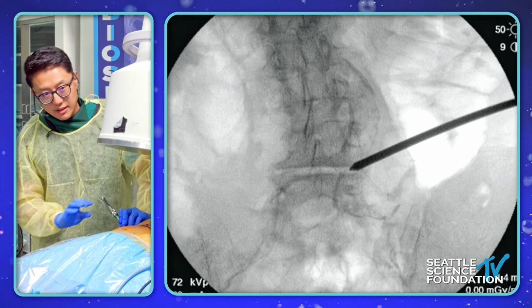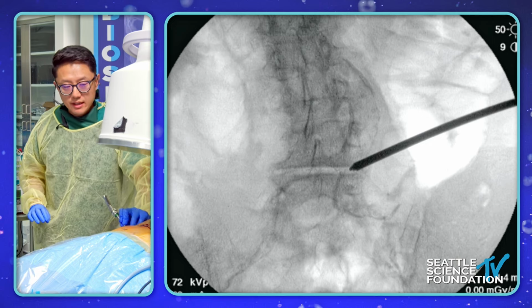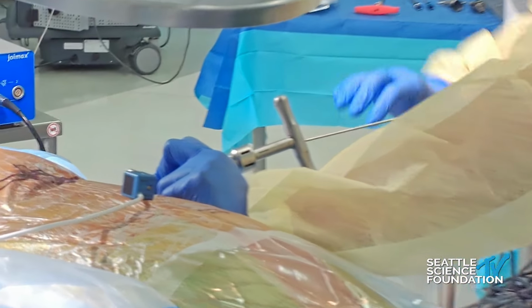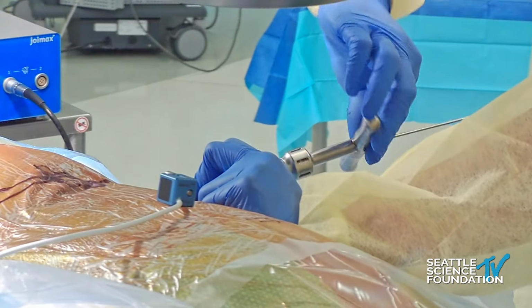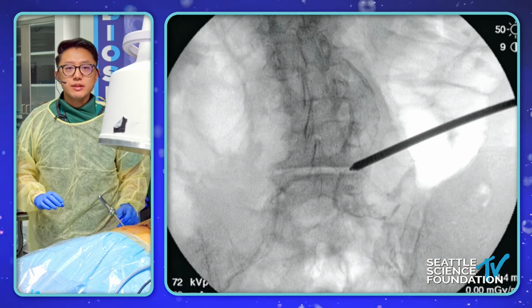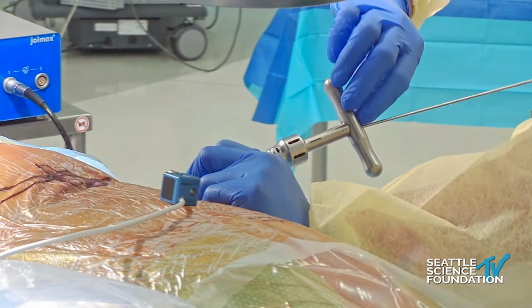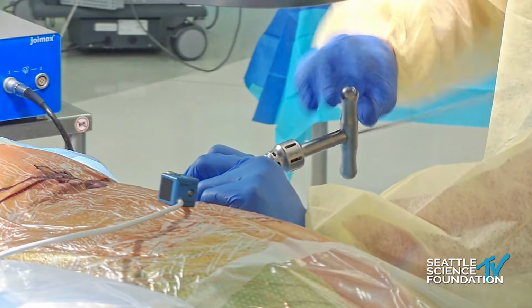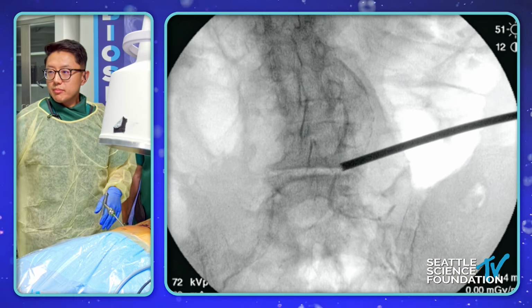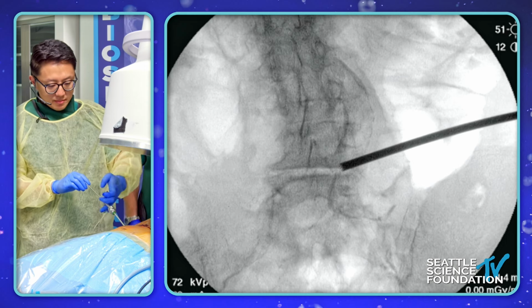If you look at my hand, I'm applying all my forward pressure with my left hand, and I've got it stabilized on the body so that I can't really plunge too much. My right hand is really just rotating the crown reamer. Most of the force is being applied with my left hand. That way you can avoid over-reaming and plunging into the canal. Now we're approaching that medial border of the pedicle. Let's see a shot there. You don't want to go beyond this line, because this line obviously means that you're in the spinal canal. So I'm going to stop there.